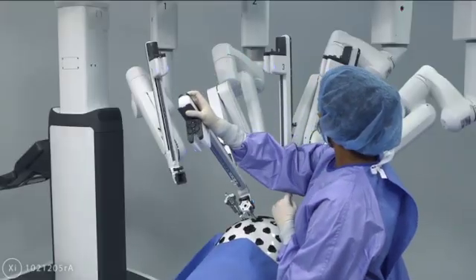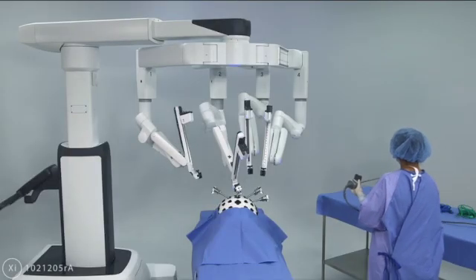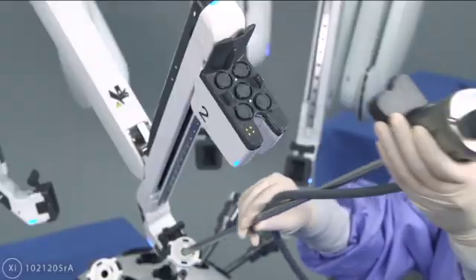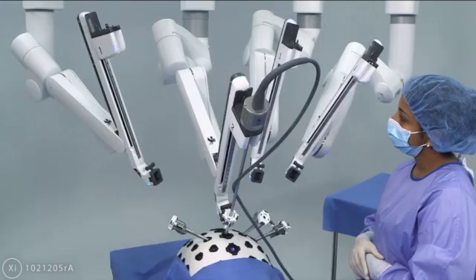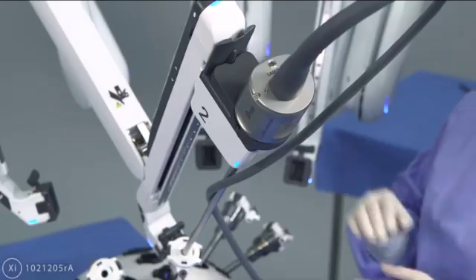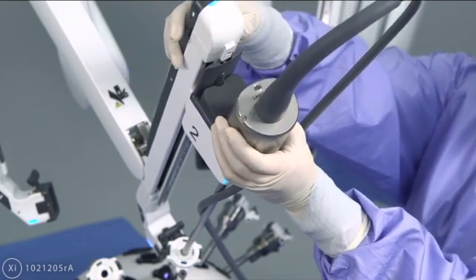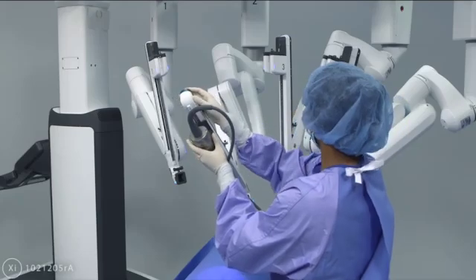Now install the endoscope. A sterile staff member then installs the endoscope onto the arm. Point the scope at the target anatomy, then press and hold the targeting button. Using the instrument clutch button, he or she gradually inserts the endoscope to point at the target anatomy.